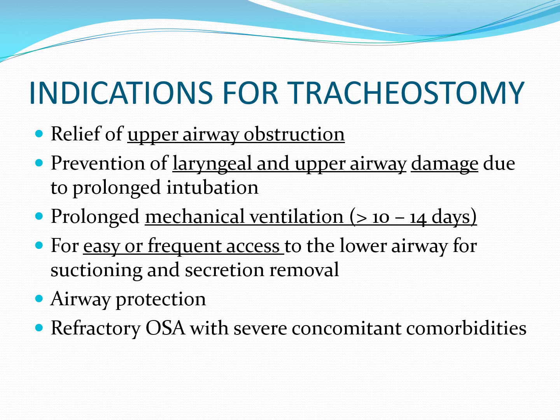So what will often happen for patients who are on mechanical ventilation and have an endotracheal tube in place at about day 10 or 12 or so, the discussion will ensue. Gee, can this patient be liberated in the next few days? Have they failed prior attempts? And if the prognosis for them coming off the ventilator at, again, day 10 or 12 is not imminent, it doesn't look like it's going to happen in the next 1 or 2 or 3 days, then the patient will probably likely be a candidate for a tracheostomy tube.